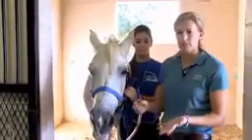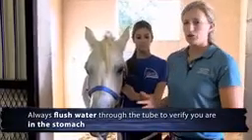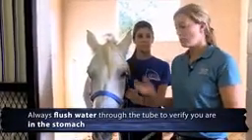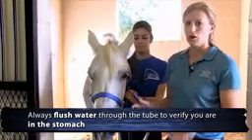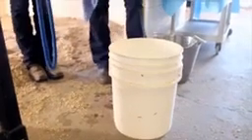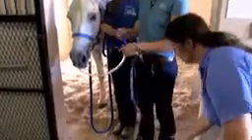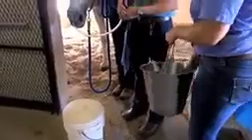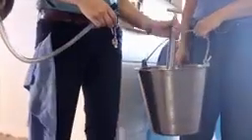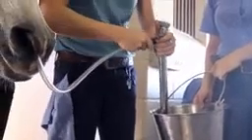So now that you're in the stomach, we have all the signs that we should be in the stomach and not in the trachea. You always first want to put water through the tube, because if you were confused and maybe in the trachea instead, water's the most harmless thing you can put in. So we'll just grab the bucket here, and this can just catch the contents of her stomach and the water that we put in just to lavage the stomach out. So then I'll have an assistant come here and hold the bucket, or if you are in a stall like this, you can sometimes just clip it onto the stall door. So this metal pump here, I'll just pump the water in, and it fits snugly onto the end of this tube.